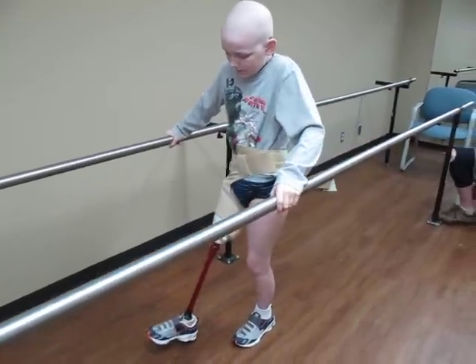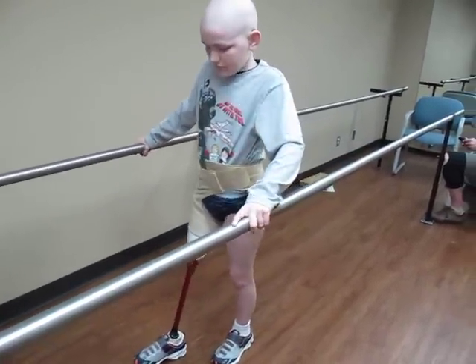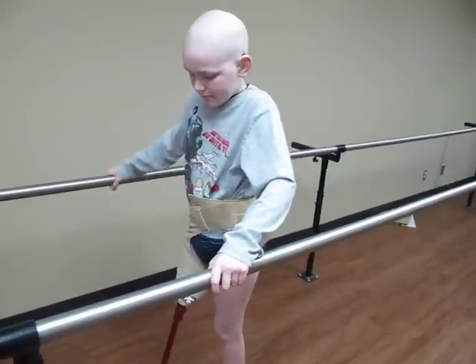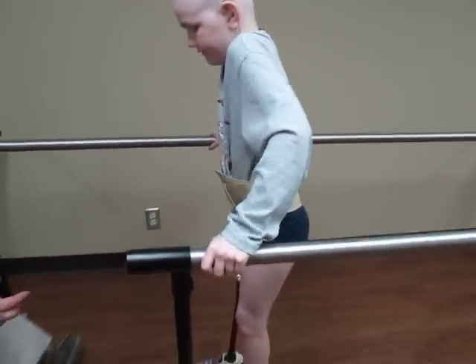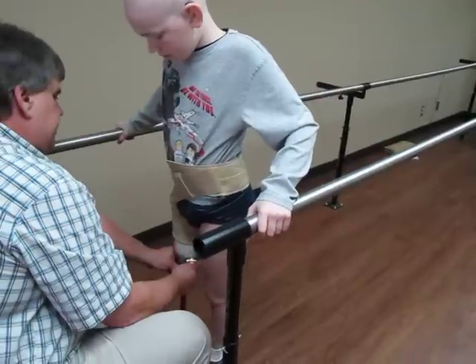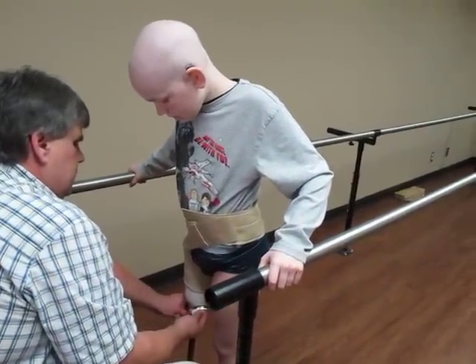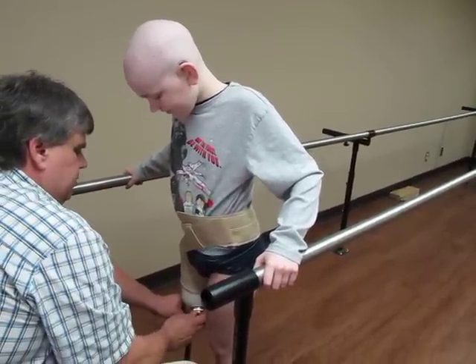Give me five — shoes on video. Truman, you're doing awesome. How's it feel, buddy? Good. Okay, let me just stand here and kind of check where you're at, just down here, and we'll see how far down you're at. Can you tell me how far you're in? Not quite, but you're close. That's good. Just keep walking.